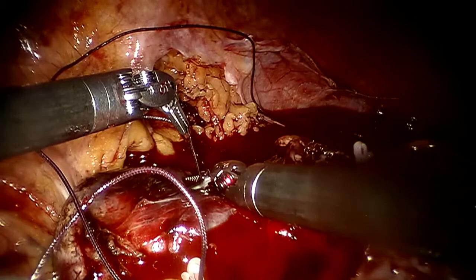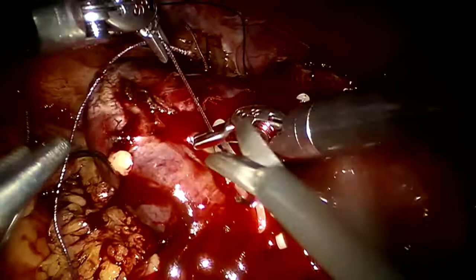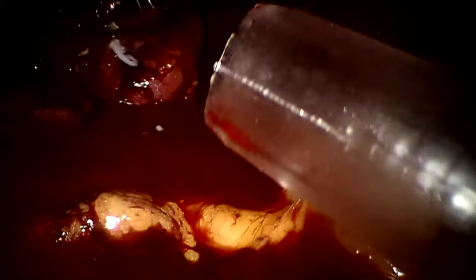Cut, please. We will flip it back and make sure the hemostasis is good. Never try and take out two needles at one time. You will lose the needle most of the time, so that is a bad shortcut. Needles always should come out one by one. Two needles should not be taken out at the same time. Even if it is a small needle.